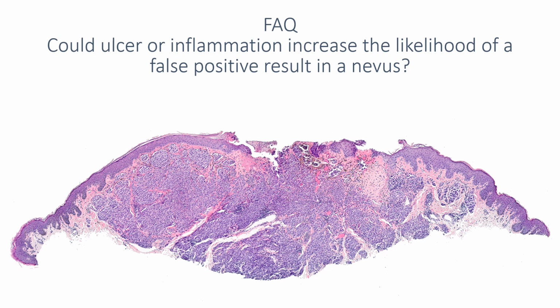Now, we generally avoid sampling areas of a tumor that are ulcerated or contain dense aggregates of neutrophils, and in the years since, we've tested hundreds of inflamed nevi of every possible variety, including dozens of halo nevi, traumatized nevi, and recurrent persistent nevi. And the overwhelming majority generate the negative score we would expect, and in a few cases that did produce unexpected malignant scores, other information later came to light suggesting that they weren't benign nevi after all.